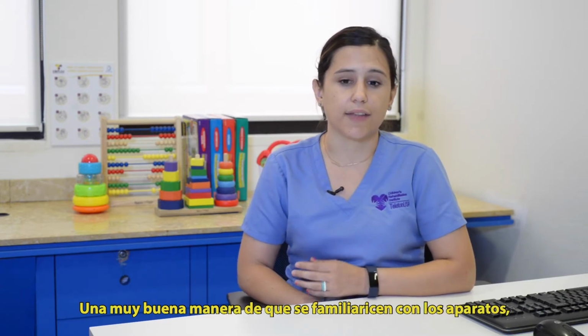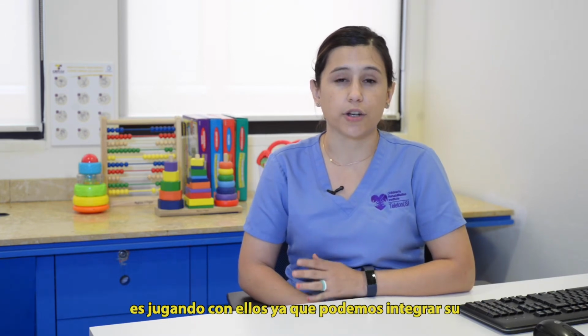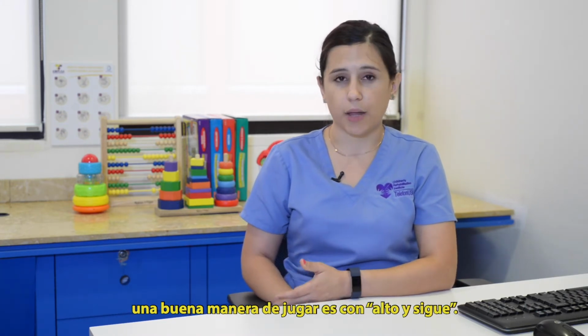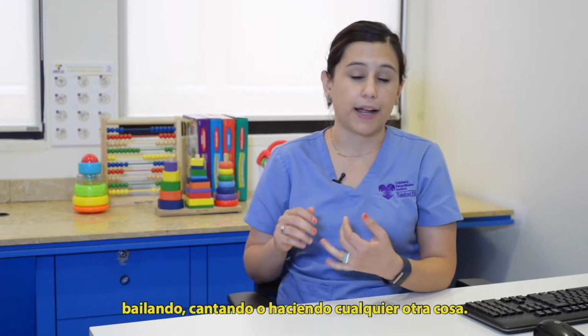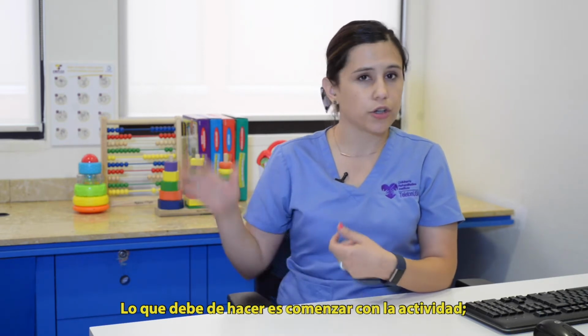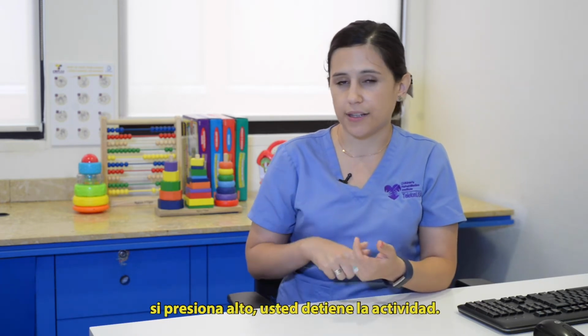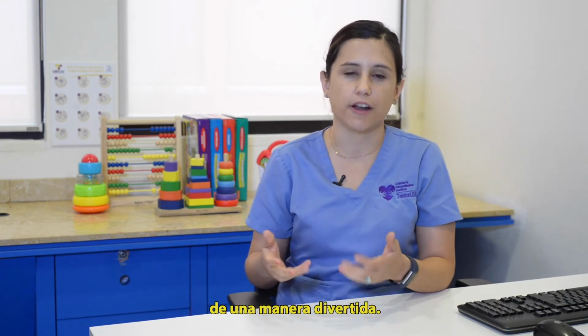So a really good way to get them to familiarize themselves with their device is to get them to play. So we can integrate their AAC system into a game. If your kid is just starting out with a field of two options, a good way to play a game is just to have stop and go. You can help get their attention by playing a silly song, by dancing, by singing, anything to get their attention. So what you do is you start doing the activity, and they're the ones that have the control, so they hit stop. When they say stop, you stop the activity. A really, really easy game to get them interacting with you in a very fun way.